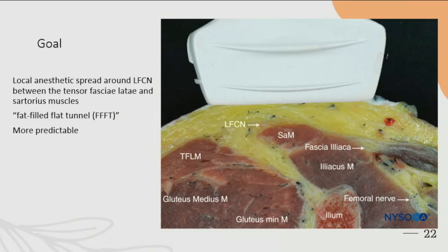So the trick is your LA goes to this fat filled flat tunnel. It's triple FT. Articles say that sometimes when you can't see the nerve, it's okay. You just deposit in that triangular area.